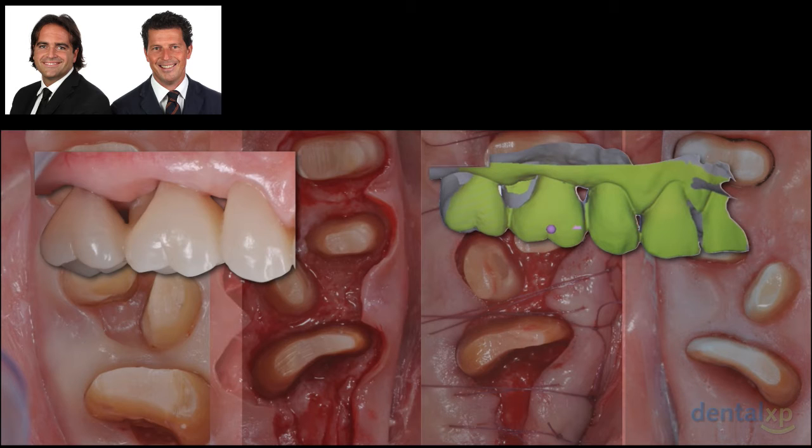Let's take for example this case in which we place the provisional in place for our patient. We wait for the soft tissue healing after the surgery, and we let the patient functionalize our provisional by herself. Once she functionalized and customized her provisional, we scanned it, and in this way we have a perfect replica of the function of our patient.